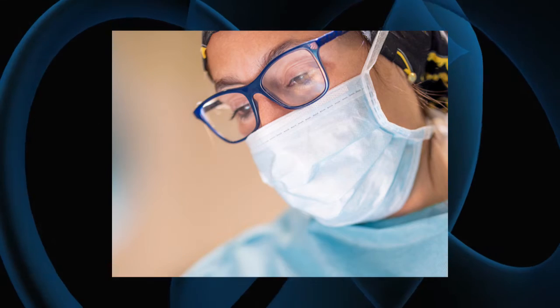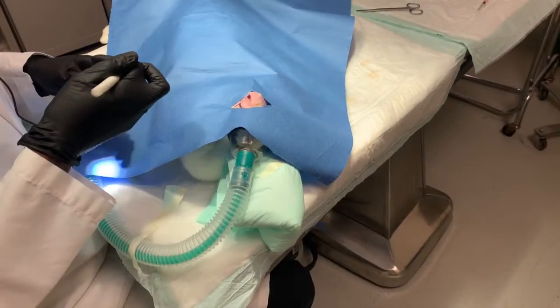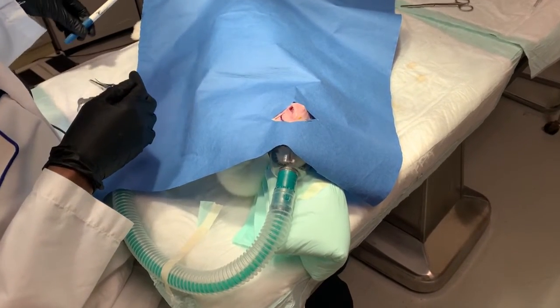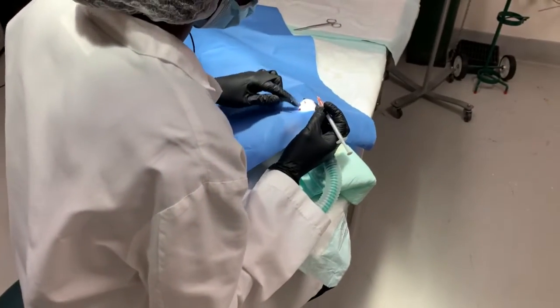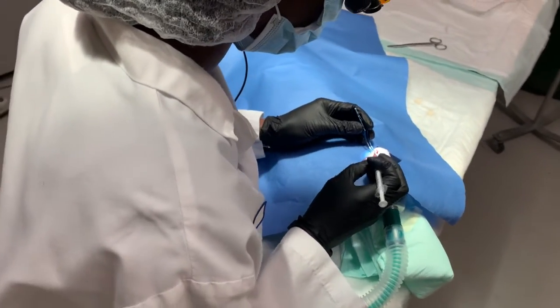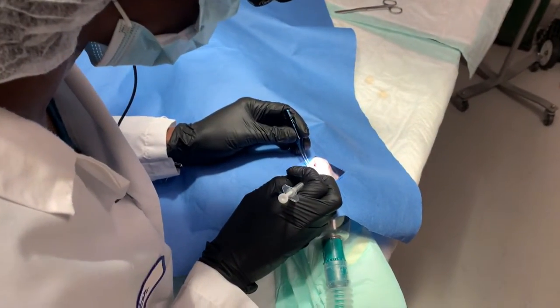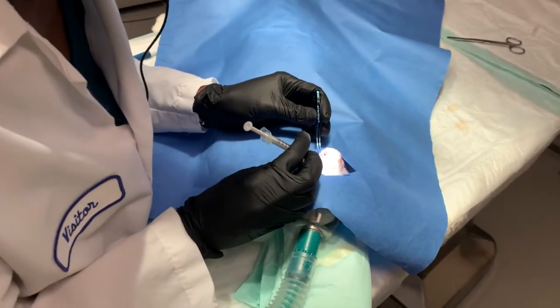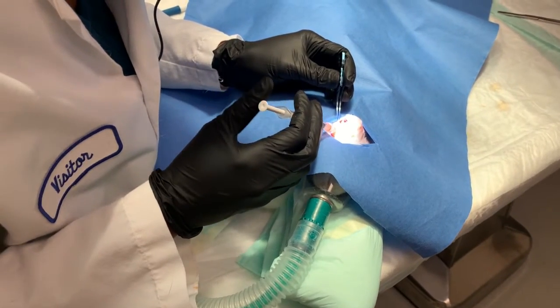The surgeon wears a mask, bonnet, and sterile gloves to conduct the procedure. After the rabbit's eye area has been clipped and anesthetized with lidocaine, the surgeon then marks the area where the needle will be inserted. Using fine-tooth forceps and a syringe, a fine needle penetrates the gland directly with a transconjunctival approach. While advancing the needle, the surgeon injects a small volume of Con-A solution into the lacrimal gland. After withdrawing the needle, the surgeon applies pressure around the lacrimal gland area to prevent backflow. The rabbit recovers.